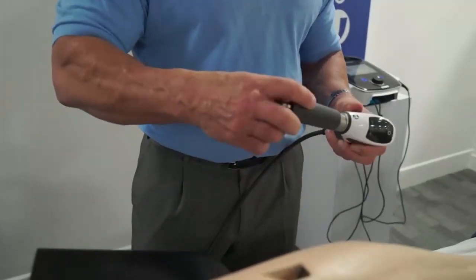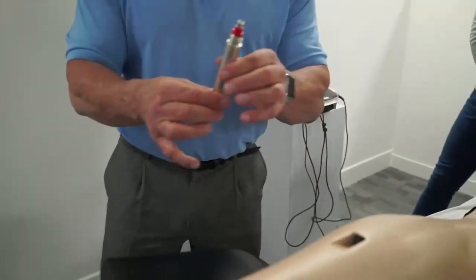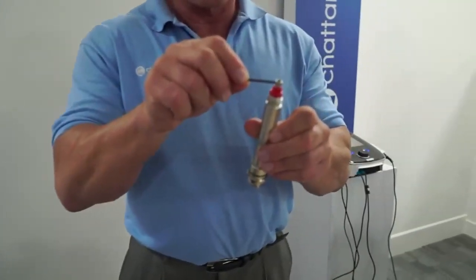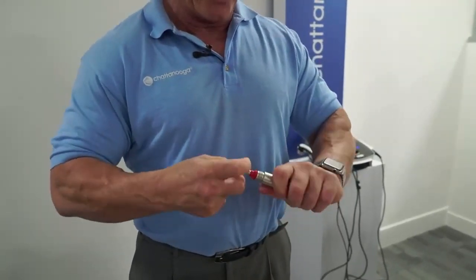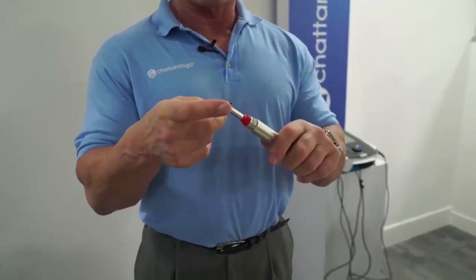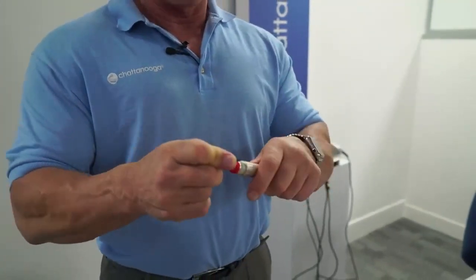If I unscrew the barrel here, here's the barrel. It comes complete with a little Allen key which goes in that hole, and you literally pull and twist and the tube comes out. You have a replacement tube and you reverse the process. You put your Allen key in the tube and you press it down until it's fully home.